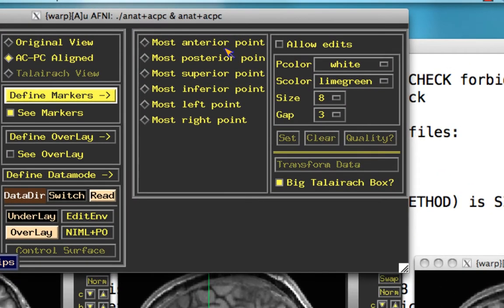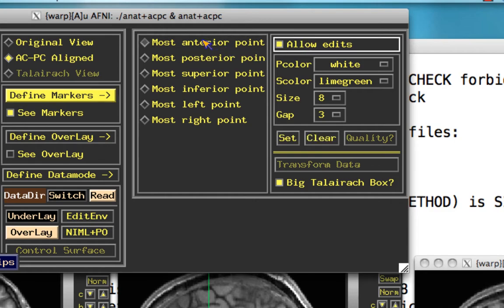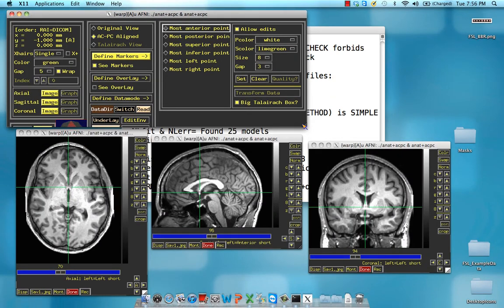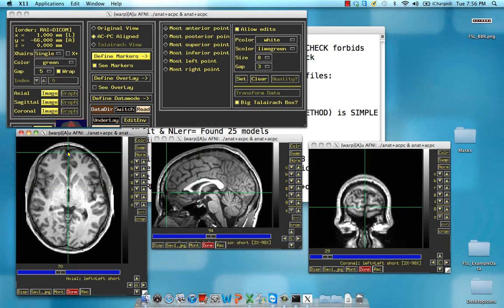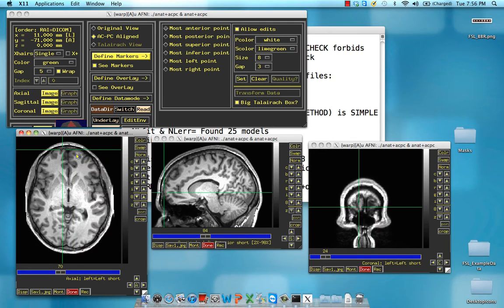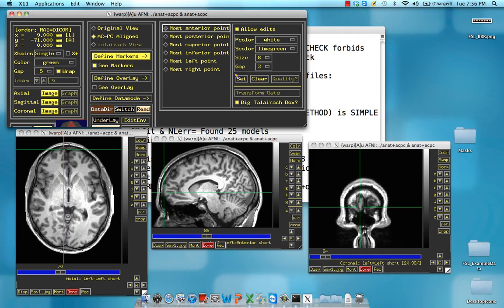Click on Define Markers again. Now we need to locate the extremes of the cerebrum. Click on Allow Edits again, and now find the most anterior point. When we talk about the most anterior point, it doesn't mean in the middle — these two hemispheres can be slightly different in how far they jut out, so we want exactly the farthest, most extreme point. You can see the left hemisphere is jutting out slightly more. Verify that with all three views to make sure you're at the very tip of the anterior point of the cerebrum. Click Set, and now move to the Posterior Point.